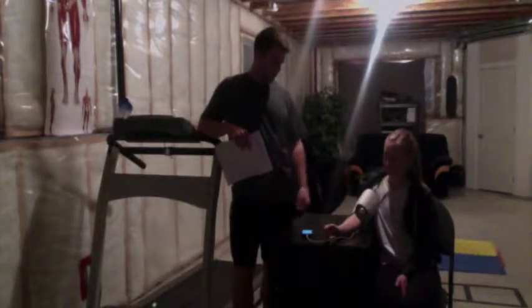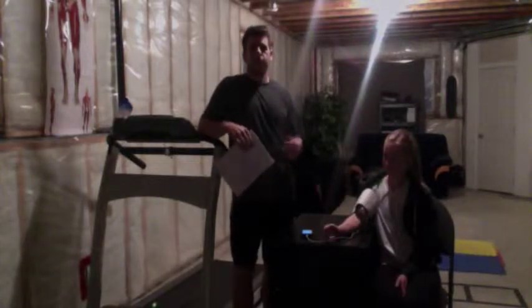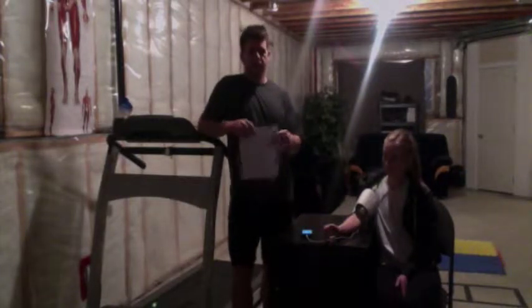So as this calculates her blood pressure as well as her resting heart rate, I'd like to explain that we have performed a graded exercise test to maximum on the treadmill here, and that was done to determine her VO2 max. The test was based on her running at 1.5% grade.